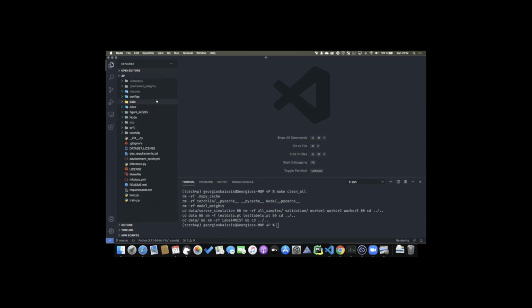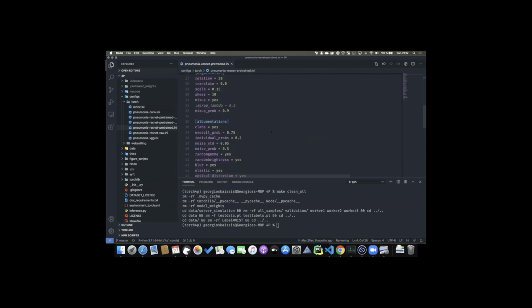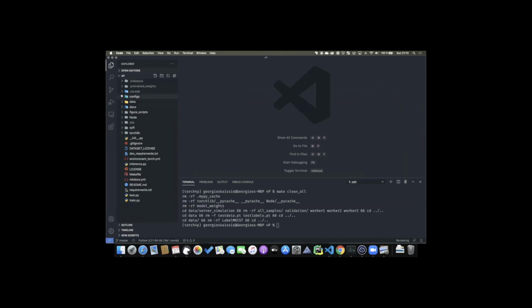You'll also find some other folders. There's a configurations folder. This contains the configurations file, and Alex designed this library so that you can do all of the configuration for the deep learning from one initialization file. So you can set everything you want in here. There's also some files which set the behavior of the PyGrid nodes. If you're unfamiliar with PyGrid, it's essentially the networking infrastructure for federated learning and the clients. And you can put in the IP addresses and the names for the clients here. The library will read it and use it for federated training. I'll show you how this works in a second.